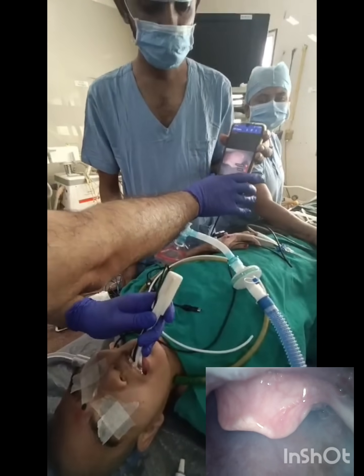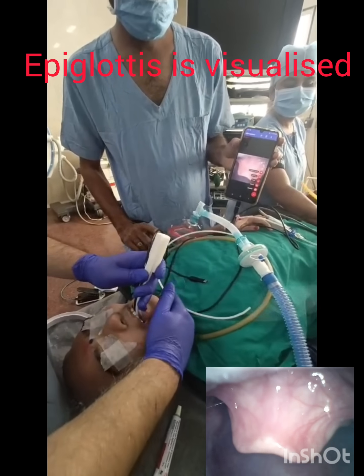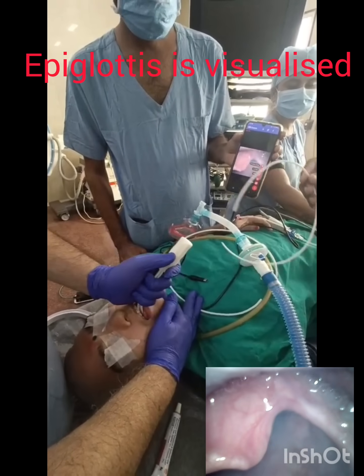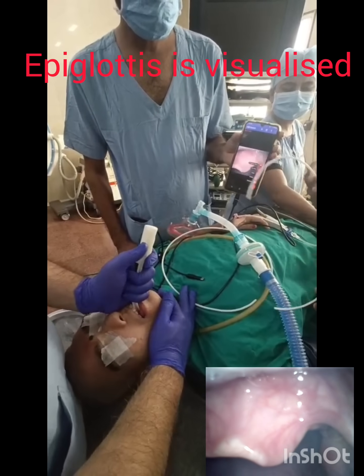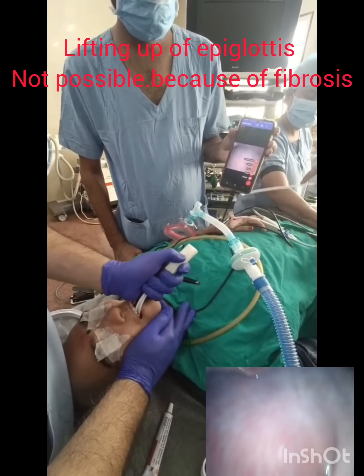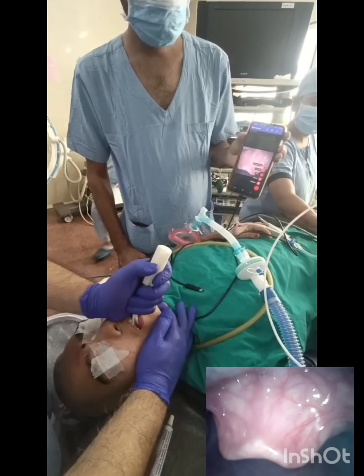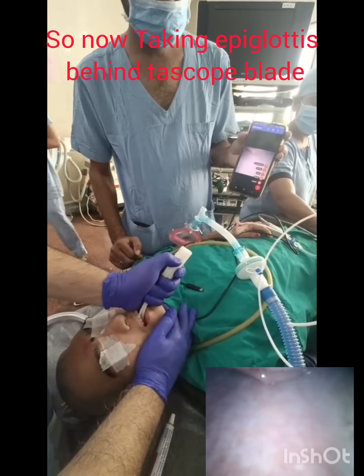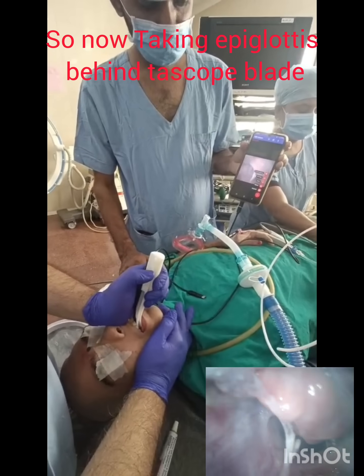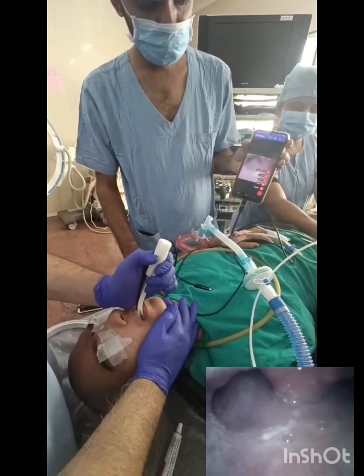Here we are able to see the epiglottis, but the larynx is difficult to visualize because of the prior operation and surgery — the larynx is not visualized. We need to take the epiglottis inside. Yes, here is the larynx.